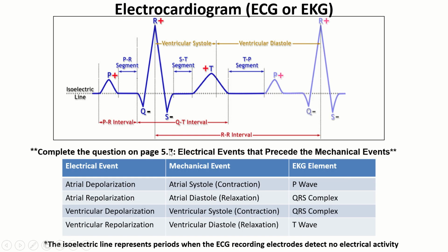But as you can see once again here, this is going to be measurable from the tip of the R peak of the QRS complex in one cardiac cycle all the way here to the R of the QRS of the next cardiac cycle. So at any point in time, if you're asked to measure heart rate by looking at a single cardiac cycle, you can just use your I-beam cursor to measure from R to R. These are the most easily readable regions within a single cardiac cycle.